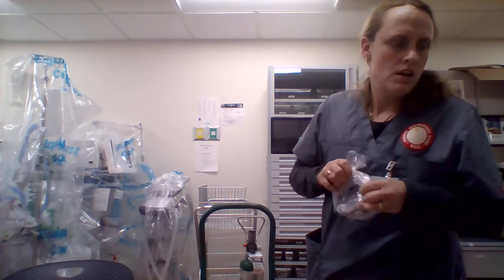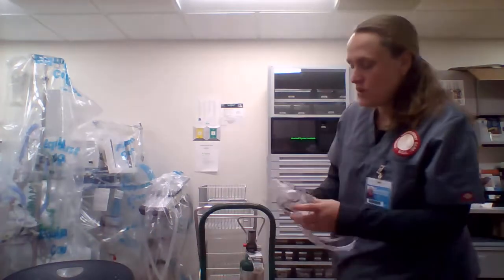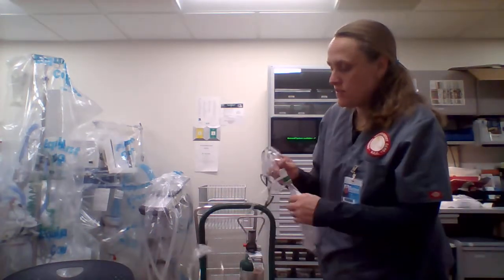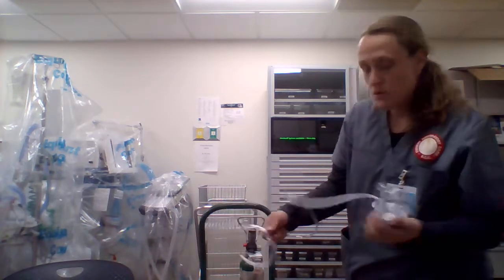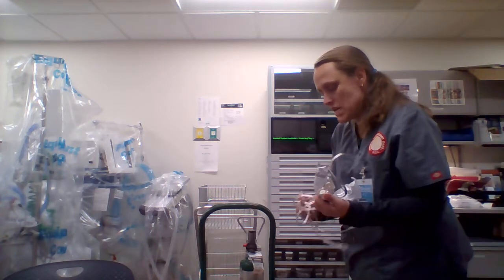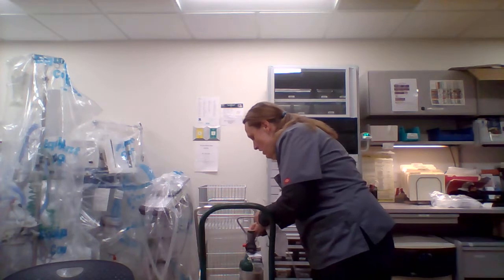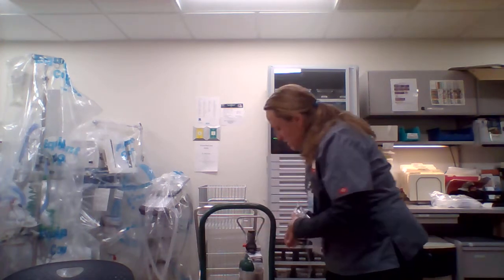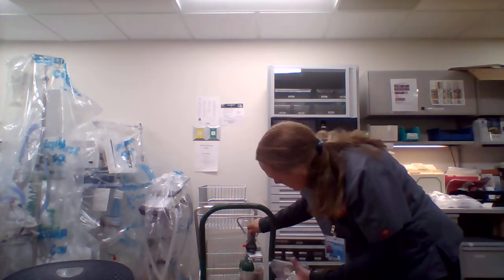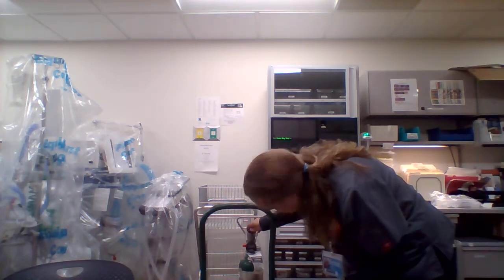Here we have a non-rebreather. And this has valves on it. There's a valve there, and there's one on here, so there's one for exhale. So it kind of mixes a little bit of room air in, hardly any. And also it's all wadded up. And I'm going to plug that in. And we want this one on at least 10. Most people go 10 to 15.